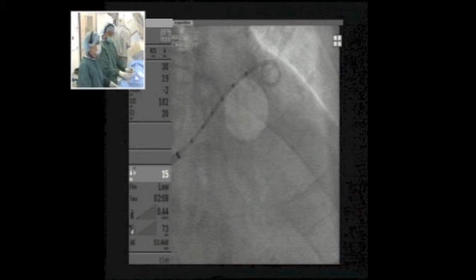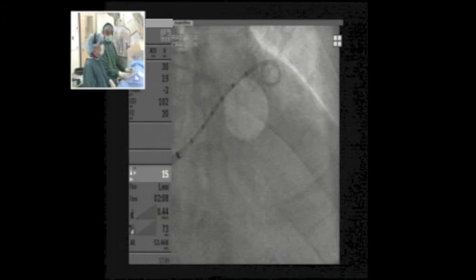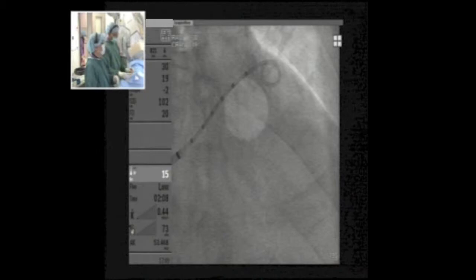One very important point: after transeptal puncture we routinely give heparin, because this is a very thrombogenic condition. We are aggressive — giving 100 units per kilogram — and we ensure ACT is at least 250 to 300, ideally near 300. We also measure left atrial pressure after the puncture. The mean left atrial pressure in this patient is about 12 to 13, which is perfect. If the patient is too dry, the LA measurements may not be accurate.